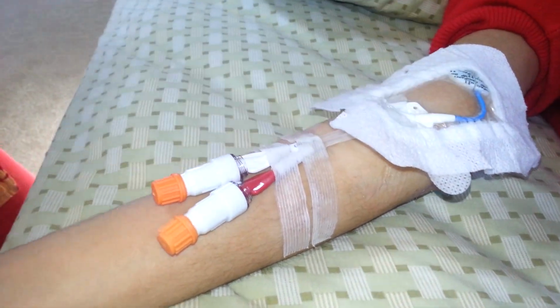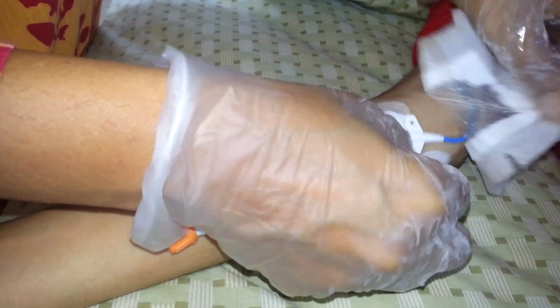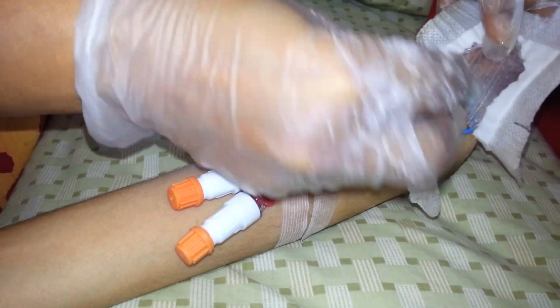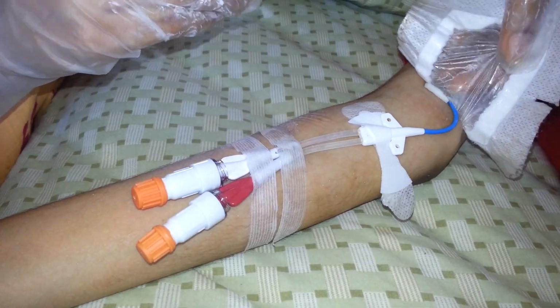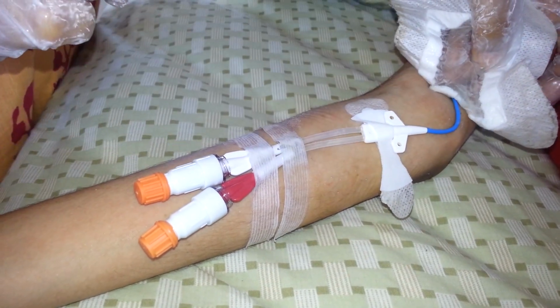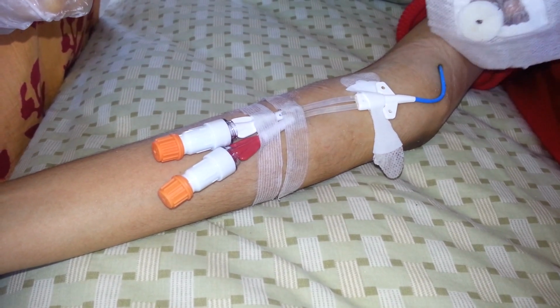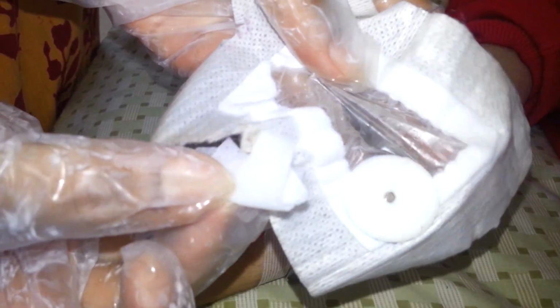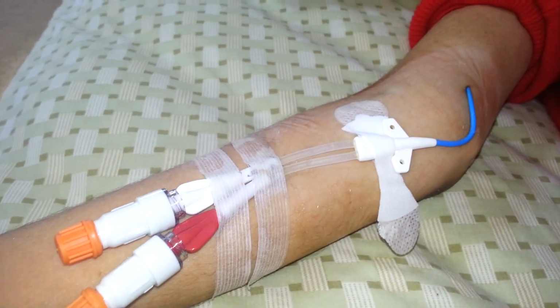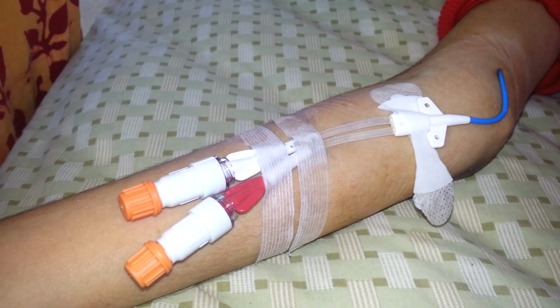Then we pull up the dressing gently from bottom towards the top, again to ensure that line stays in place. Once we reach near the insertion point, we lift the dressing along with the biopatch. If the biopatch is at the right angle, it will come off together with the dressing itself. There is no need to separate the biopatch from the old dressing. This is how it looks. But if anything seems stuck, more swabs can be used. Since we are very close to the insertion point, we are careful not to pull anything with pressure.